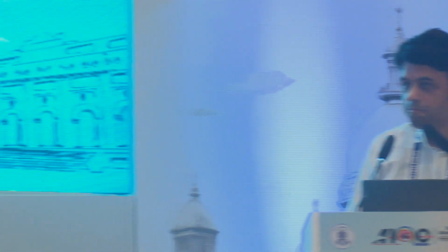Thank you, Manish, for your excellent presentation. Very nicely demonstrated the techniques, how to remove the synechia. And the 2-3 things I want to just highlight is, one is the perioperative steroid that is a must in such cases, and NSAIDs. And also cycloplegic post-operatively one can use to curb the inflammation and pain, and also delicacy in your maneuvering during surgery, that is a must.